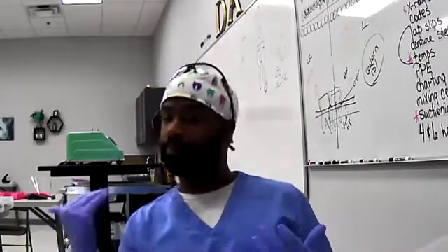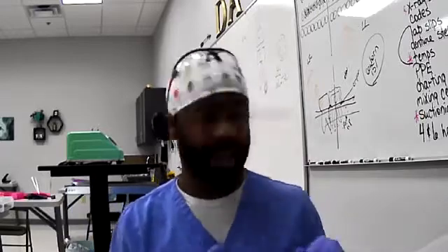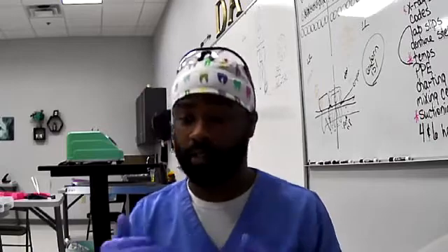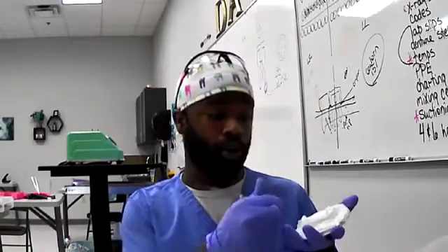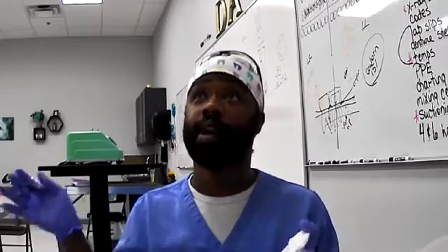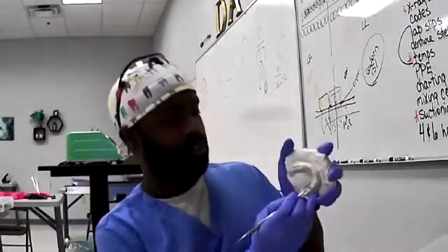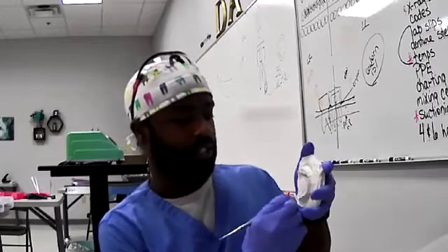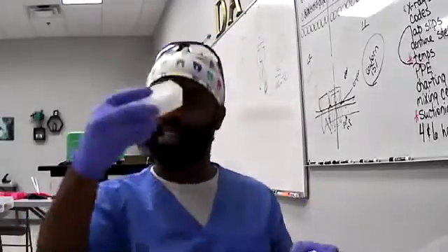After articulating paper and the articulating paper forceps, you get a scaler and floss. I didn't bring any floss. The scaler is to go around the tooth again and make sure all of the amalgam is off, that way nothing's flaking in the mouth once the patient leaves. This isn't a scaler, but this looks more like one. So you go around the tooth again, make sure all of the material that can fall off is off.